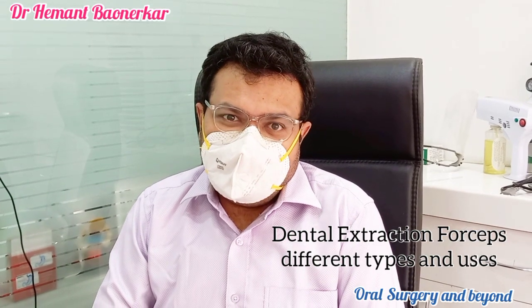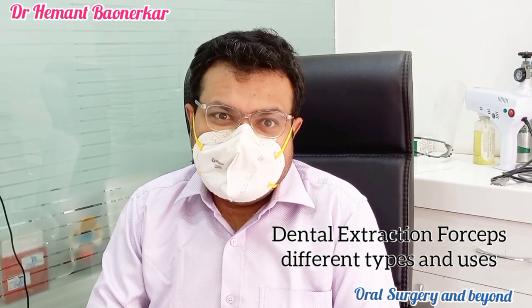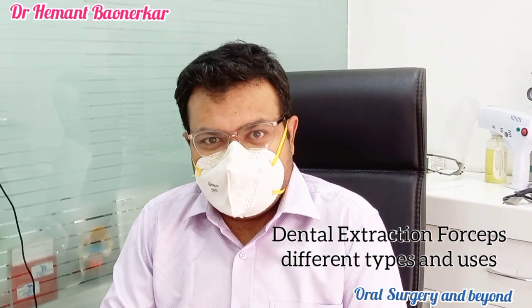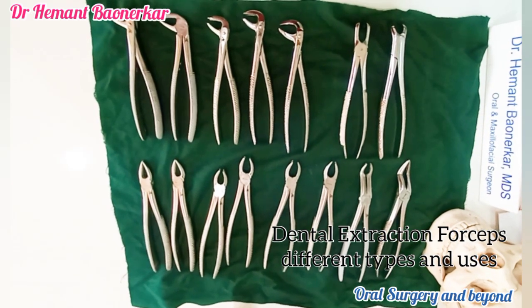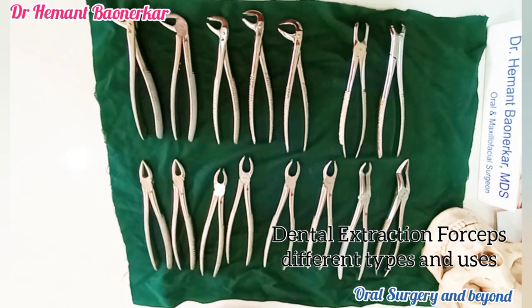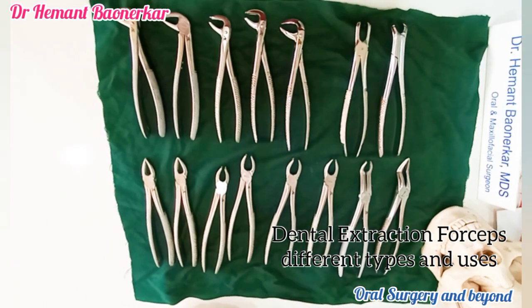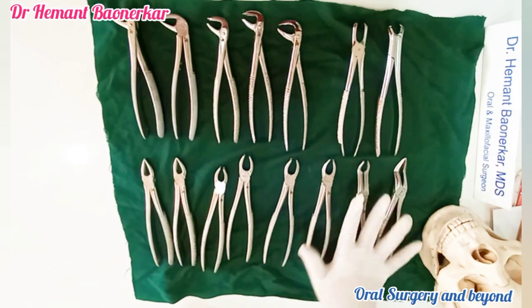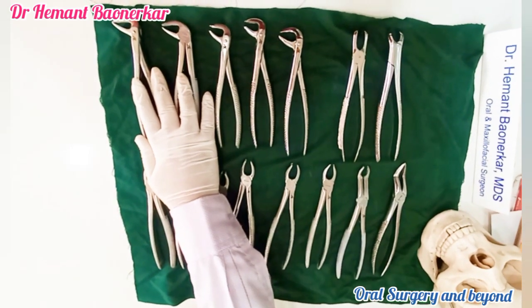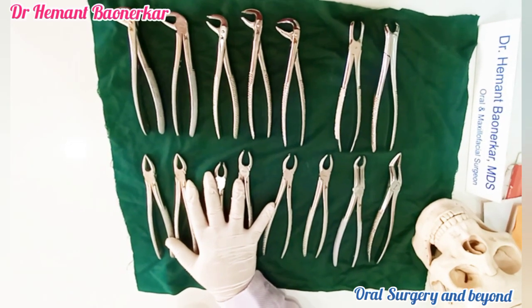Today, I am going to cover in my today's session only dental extraction forceps. Let us start with the extraction dental forceps. Basically, we use two types of main extraction forceps: one is the maxillary extraction forceps, and the second one is the mandibular dental extraction forceps. These are the main types of extraction forceps.